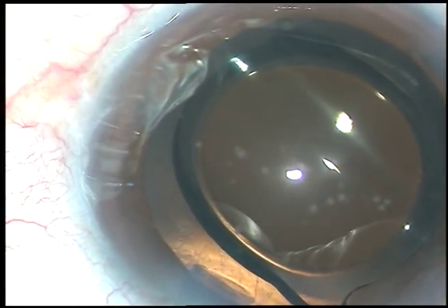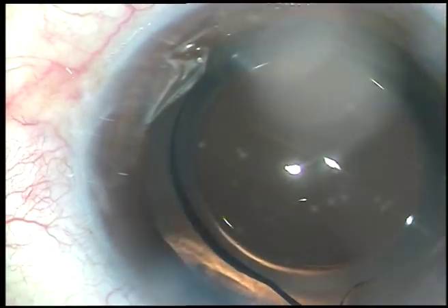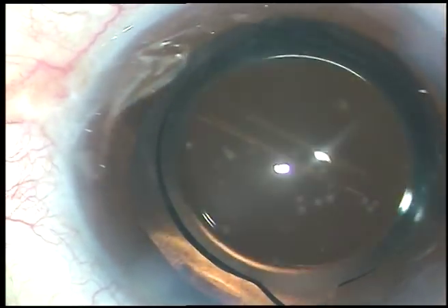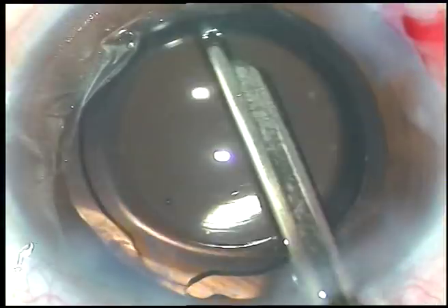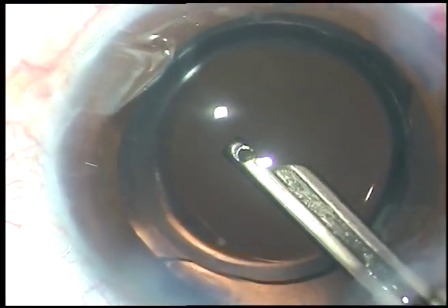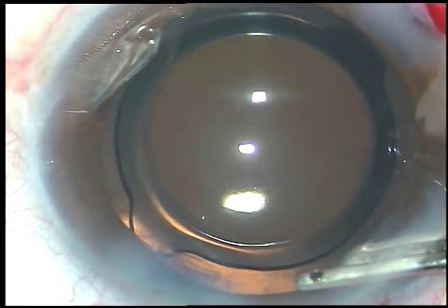A bit of moxifloxacin is added. The side ports are hydrated, and after hydrating the side ports, a final lavage of the anterior chamber is done. I use balanced salt solution — BSS. The lens is dialed a bit and the bag is also irrigated. Finally, after forming the anterior chamber, the case is concluded. Hope this video will help you in developing your surgical skills. Thank you very much for watching.